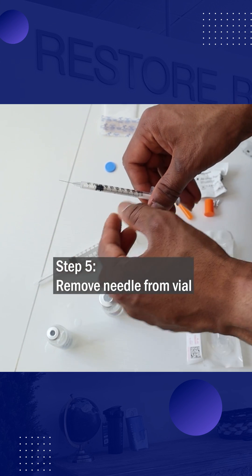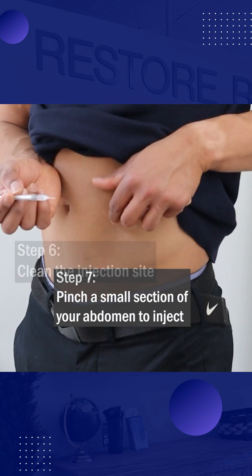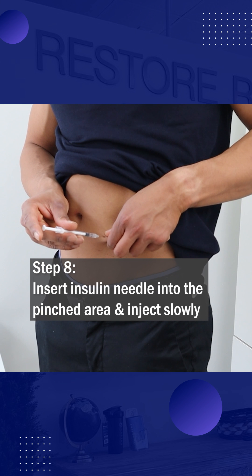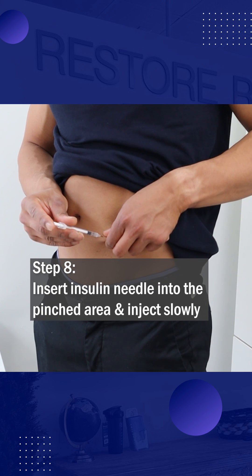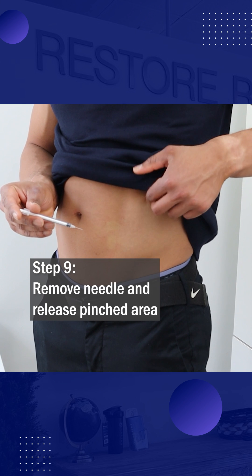Then remove the needle, swab the injection site, pinch a small area of your abdomen, insert the insulin needle into the pinched area, and inject slowly. Remove the needle and allow the area of pinched skin to release.